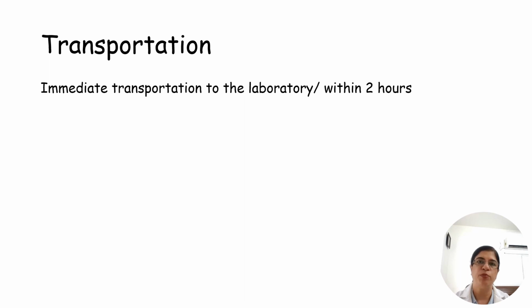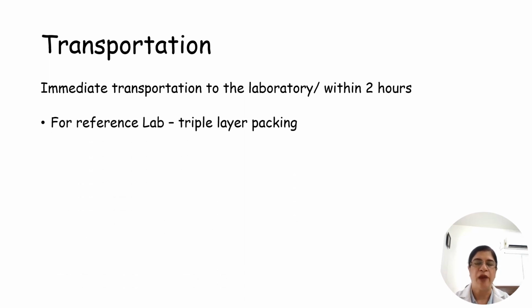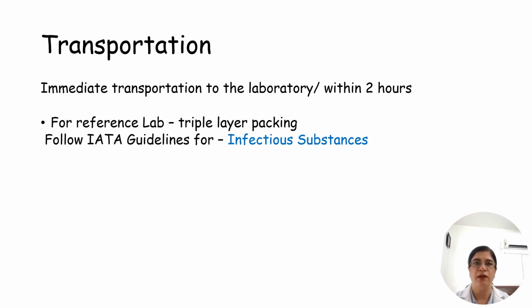Transportation of sample should be done as soon as possible, ideally within 2 hours. And for a reference lab, proper triple layer packing should be done, and IATA guidelines should be followed for infectious substances and for diagnostic substances separately.